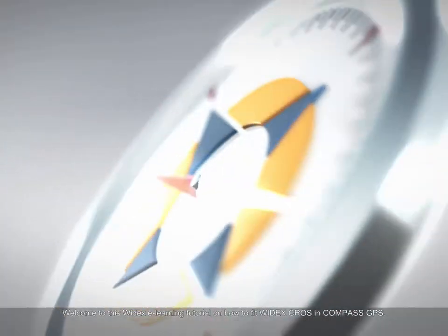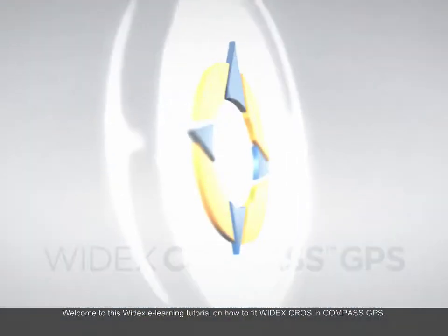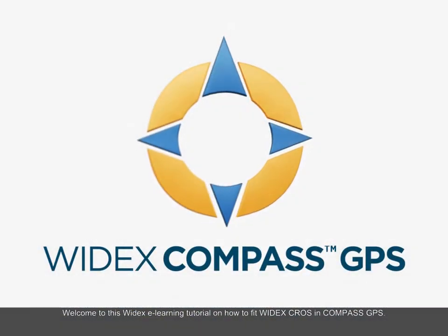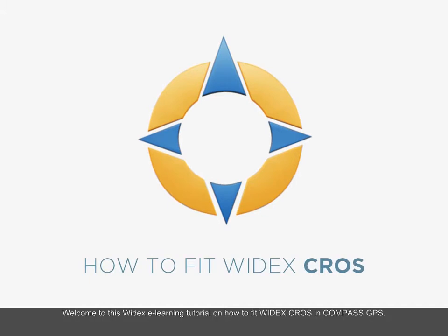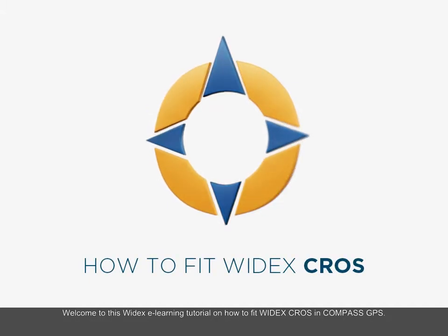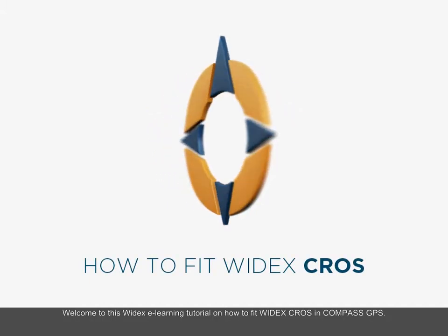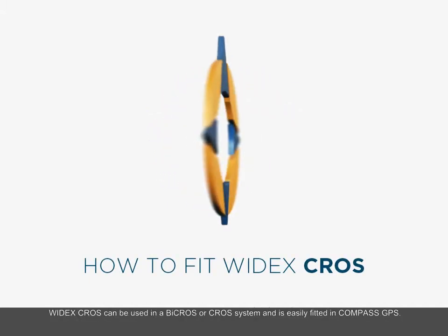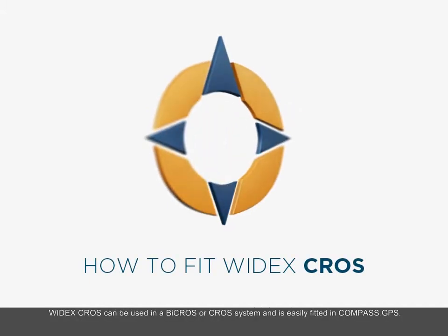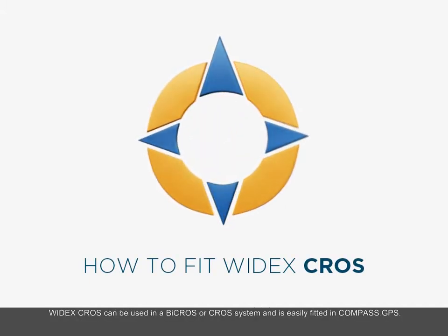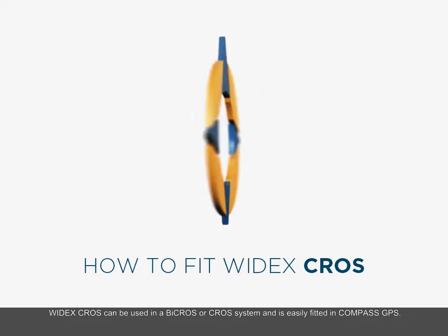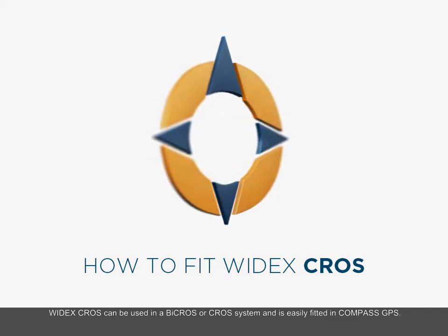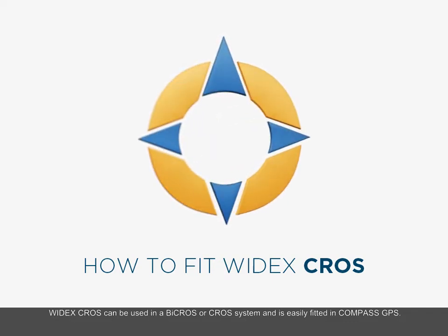Welcome to this Widex e-learning tutorial on how to fit Widex CROS in Compass GPS. Widex CROS can be used in a bi-CROS or CROS system and is easily fitted in Compass GPS.